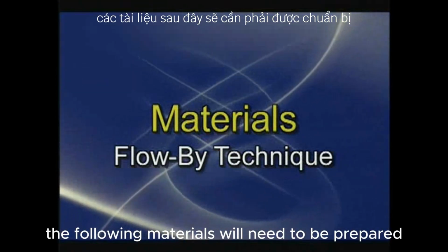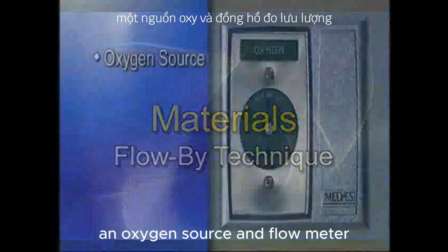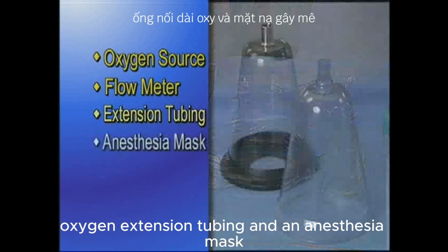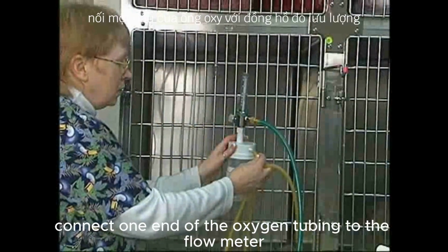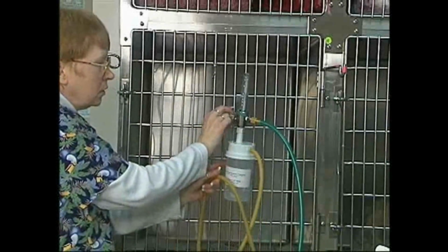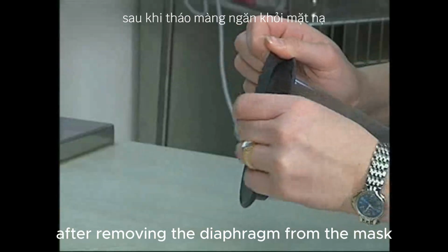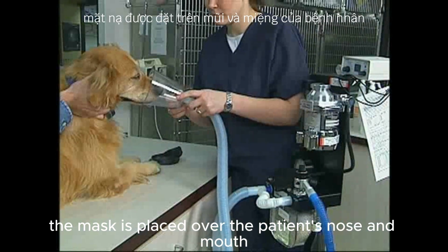The following materials will need to be prepared for a flow-by oxygen technique: an oxygen source and flow meter, oxygen extension tubing, and an anesthesia mask. To begin, connect one end of the oxygen tubing to the flow meter and set the flow to 5 to 15 liters per minute. The open end of the oxygen tubing is connected to an anesthesia mask after removing the diaphragm from the mask, and the mask is placed over the patient's nose and mouth.